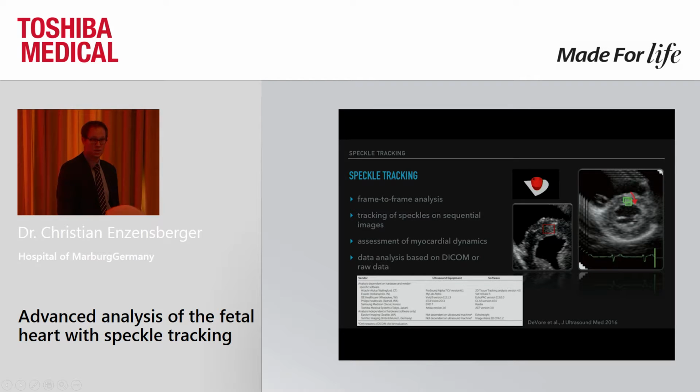This can be up to, for example, 200 frames per second or even more. But I will speak about this part later on.